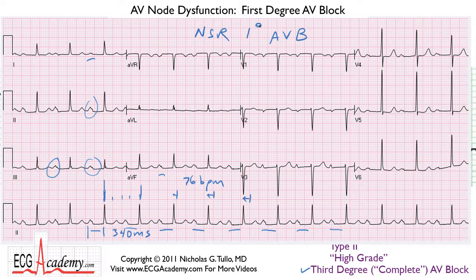That little degree sign, like the number of degrees in the temperature, that's how we sometimes abbreviate it. Some people will write out the words first degree, however you prefer. Let's look at a couple of other examples.